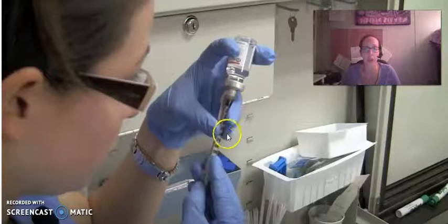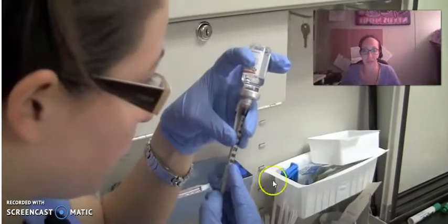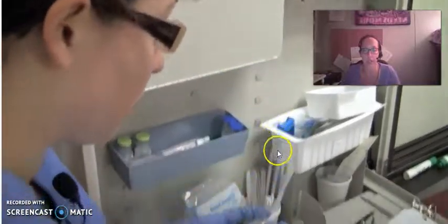Now if she were to happen to pull out to, let's say, 15 or 20, that's okay for this particular type of insulin, because she can just push the plunger back up to the 2 and not have caused any damage to what's in the current vial. But once she goes to the NPH vial, she cannot overdraw. Okay, so 2 units of regular insulin.